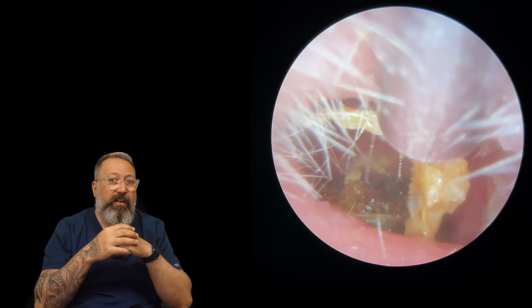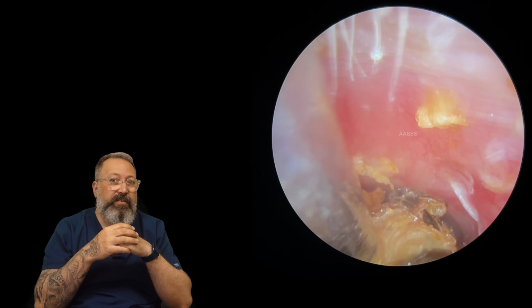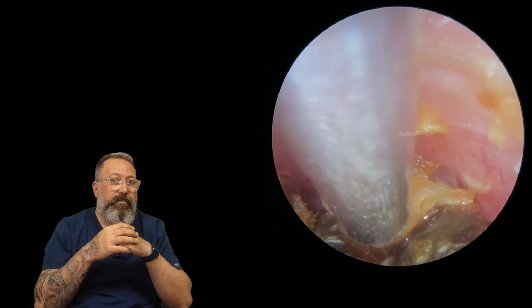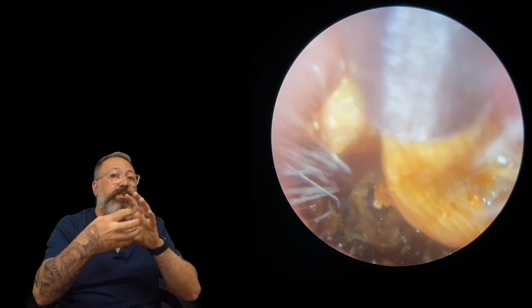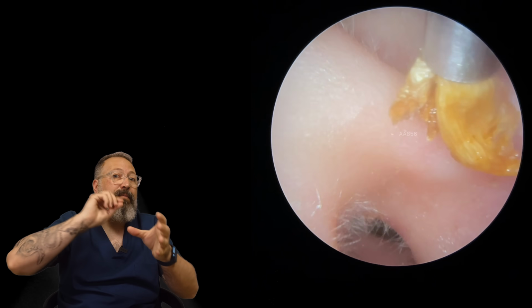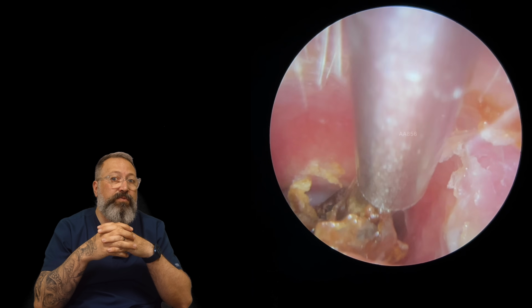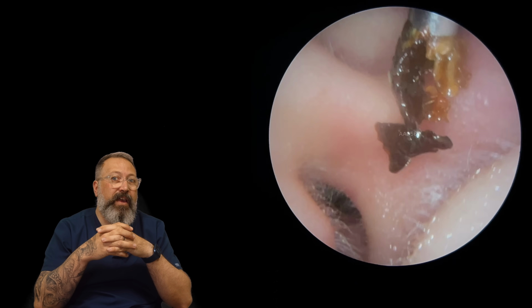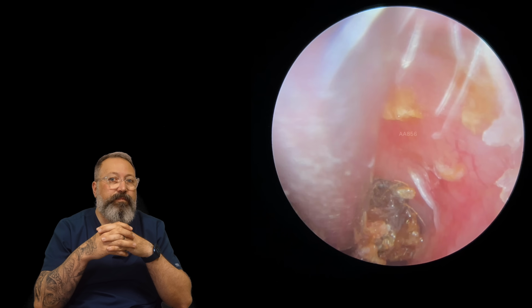Looks like there's another strip of keratin beyond it, I would say, just there. That looks like it's a ribbon of keratin interwoven into some hard wax. Let's pull that, see what happens. You can see as I pulled it, it drew another piece of wax down with it, and then the keratin came out from the gap and left the wax in place. So this was the piece of wax it pulled forward, so we'll move that next. There we go, out that comes. A little bit of a keratin underbelly to that one as well. We're getting to the end of this now.